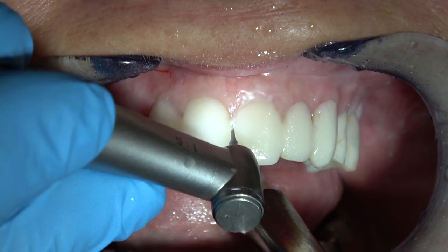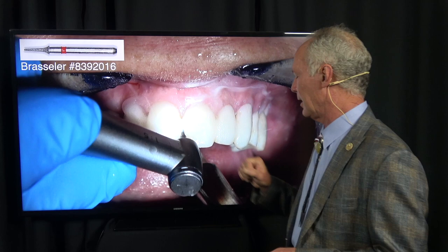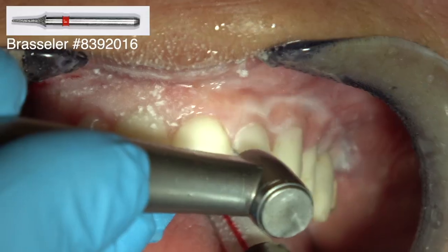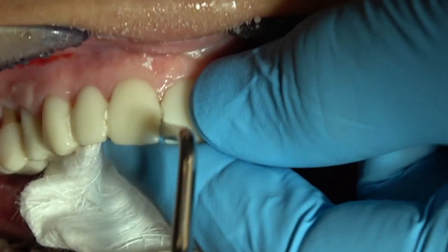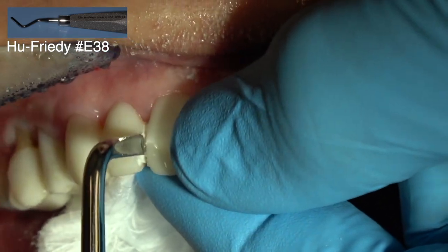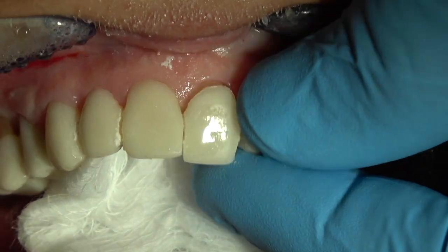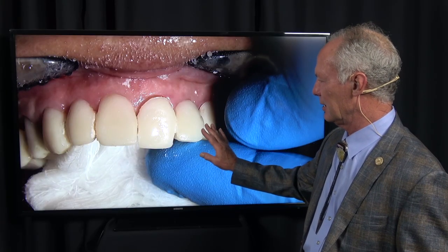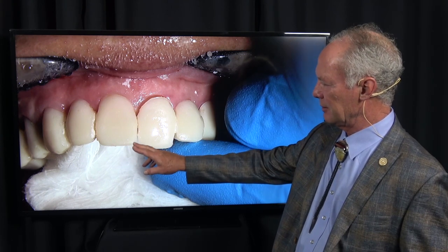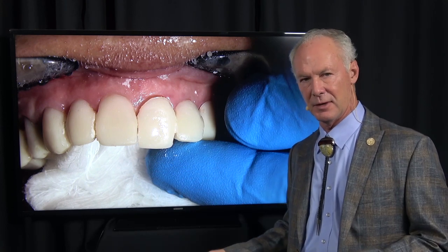This is the die model and this is the solid model. I'm removing the provisional restorations by cutting between the veneer provisionals with this little mosquito diamond - cut all the way through. Then place a two-by-two in the mouth and just torque the provisional veneers. Remember they're seated with adhesive only, no primer and no etching. The crowns on the bicuspid and molar teeth are seated with Olympia provisional crown and bridge cement.